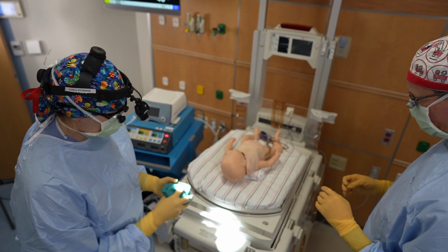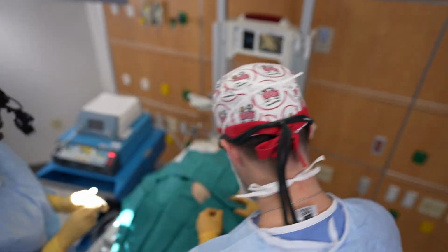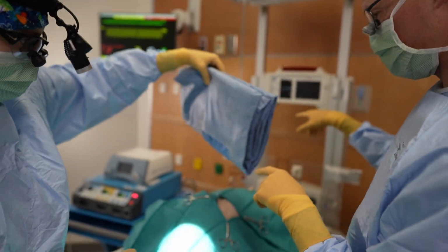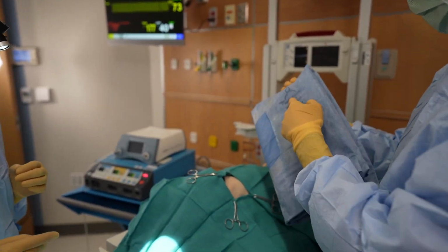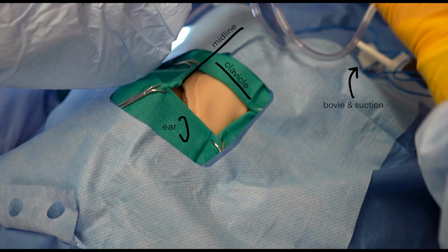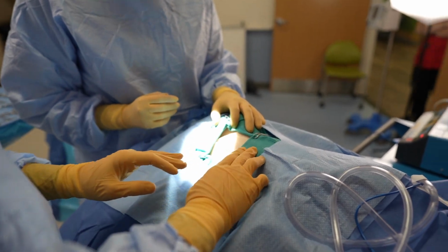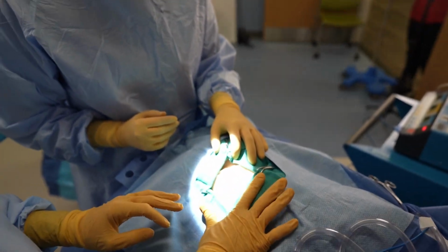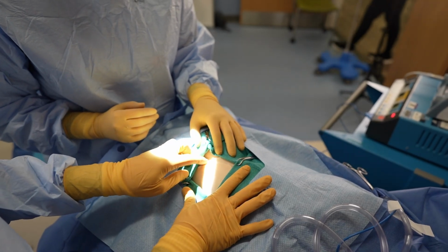We begin the procedure by placing the patient on a shoulder roll with their head moved towards the left. We prep and drape the patient, making sure to place the head of the drape towards the patient's foot. We then mark our surface landmarks with the clavicle, ear, and the trachea in the midline. We'll place a finger on the clavicle and identify the sternocleidomastoid muscle running cranially superior to the clavicle.